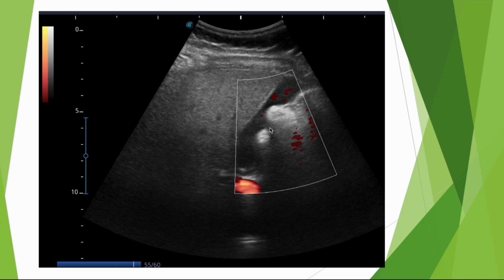And you don't end up thinking that there are two stones in a duct. Right away, you'll think shadow, impure, so gas, so the presence of gas. These are two air images, probably due to the patient's bloating and the position of the digestive tract at that spot, which is causing this. A false image of a stone, an artifact image, that is actually an air image.